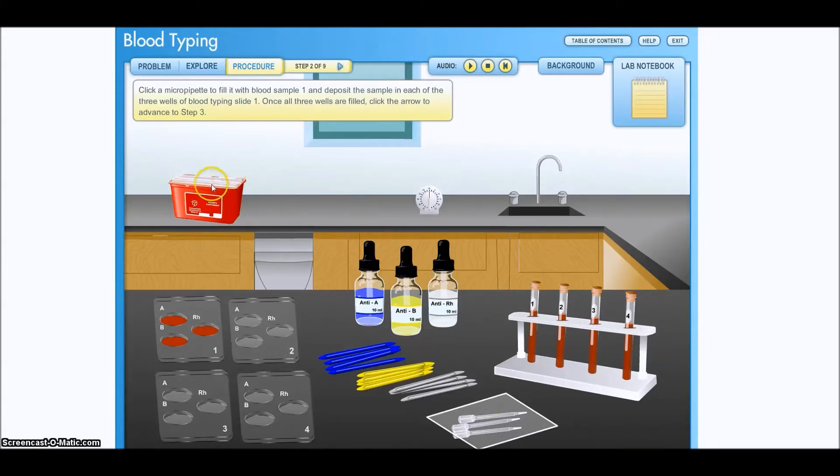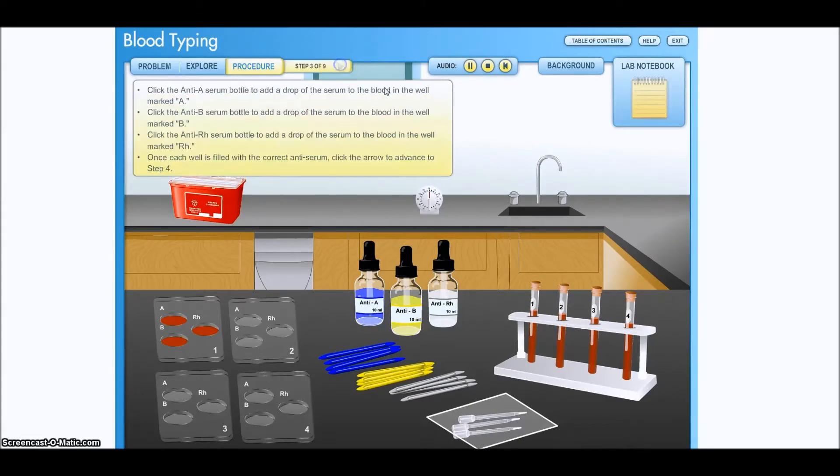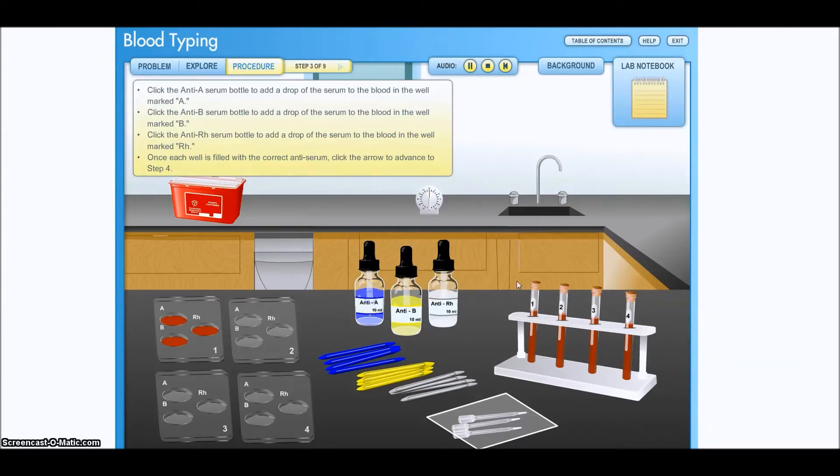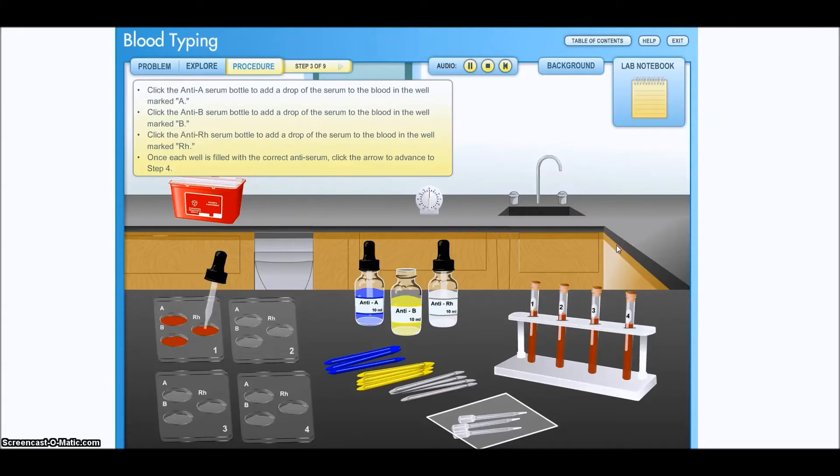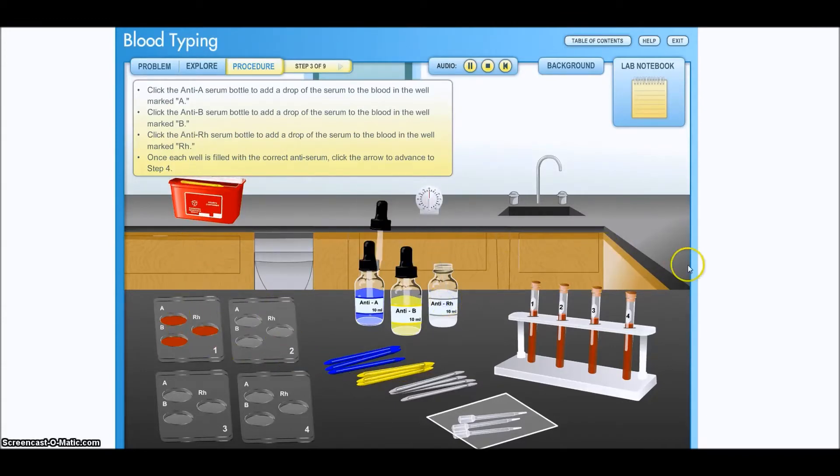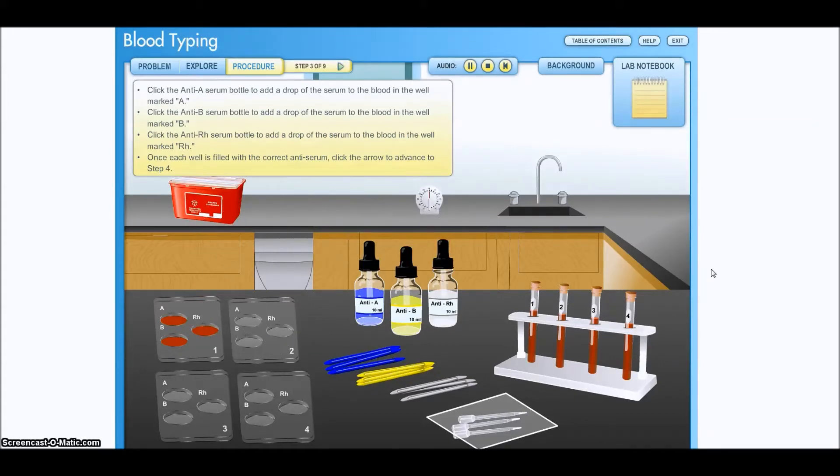You see they throw that away. So I've got to go to step three. Click the anti-A serum bottle to add a drop of the serum to the blood in the well mark A. Click the anti-B serum bottle to add a drop of the serum to the blood in the well marked B. Click the anti-RH serum bottle to add a drop of the serum to the blood in the well marked RH. Once each well is filled with the correct anti-serum, click the arrow to advance to step four.